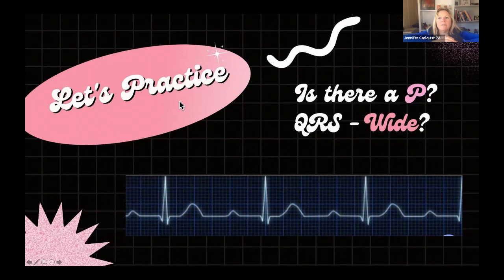Now let's practice another one here. Is there a P wave? And is it slow, normal, or fast? And here's what I found. Siri wants to play. That's so cute. But who's in charge of the heart? And is the family getting along? Ooh, Michelle. Okay, Michelle's on it.